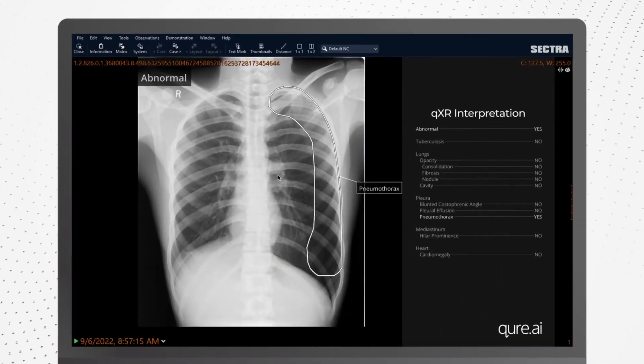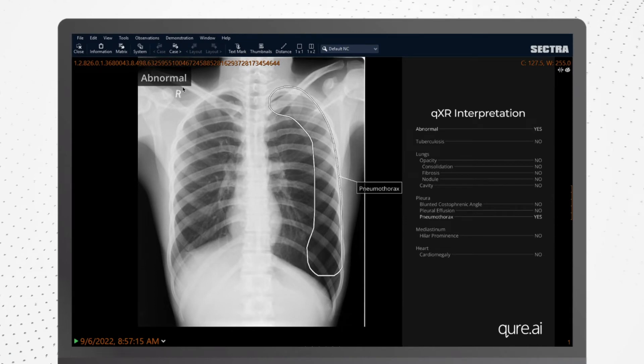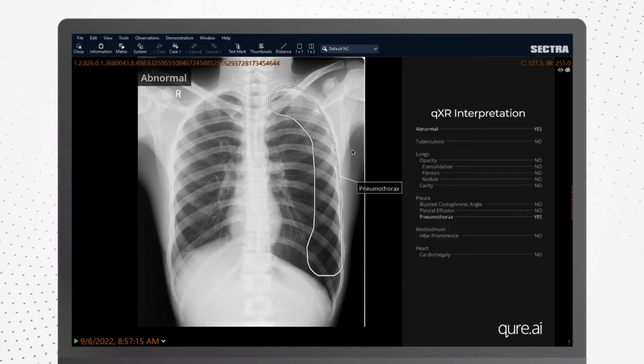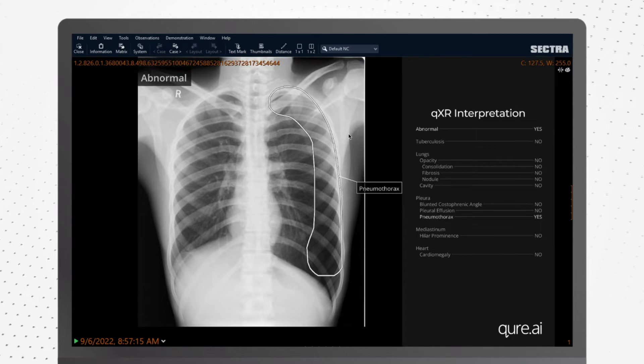QXR processes the images received by the CURE server from the client and sends back an AI overlay and an AI report with findings back to the client.